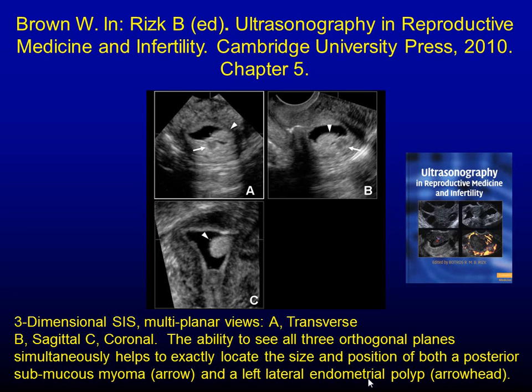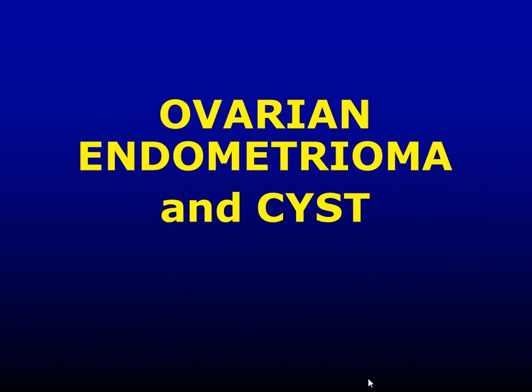The problem is that 90% of gynecologists in the US would look with the hysteroscope, would take the hysteroscope out, thank the OR nurses, and then do a polypectomy as well. So really, you haven't added much. You just added to your mental impression or information, but then it's a blind procedure. And then they end up looking at it. So you really want to remove under vision if you can. So this is the uterus, its evaluation.